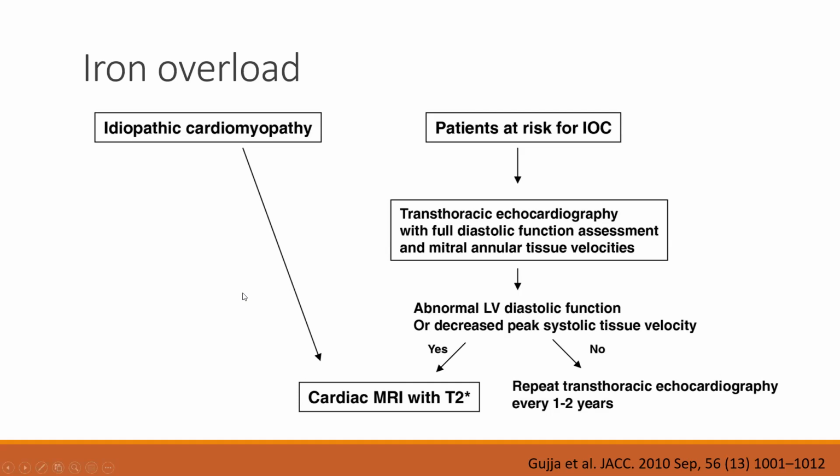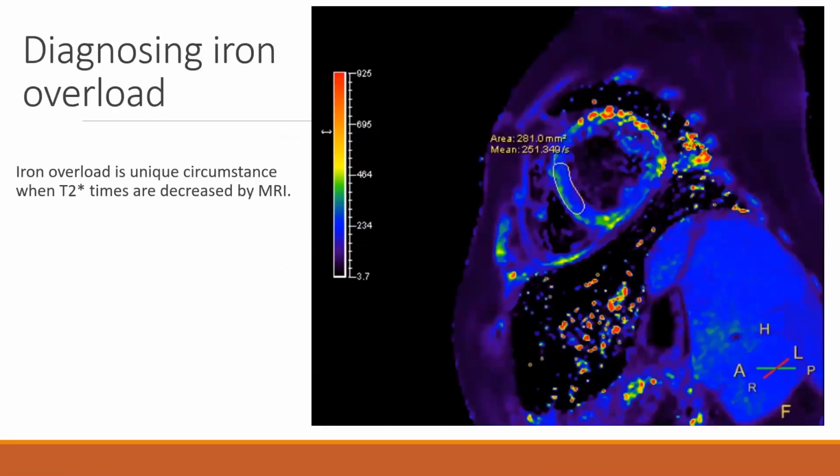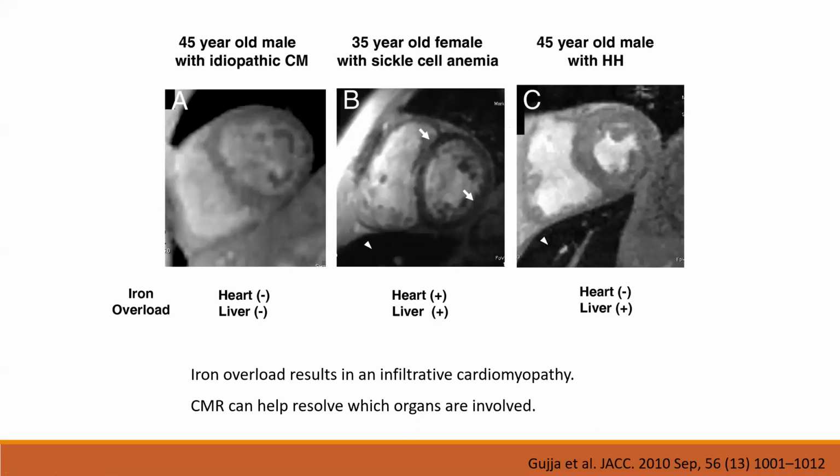For the purpose of iron overload, cardiac MRI with T2 star mapping is very good at detecting iron overload in the heart. Iron overload is a unique circumstance when T2 star times are decreased by MRI. There are very few conditions that result in that. Here's a patient from a study in JACC a couple of years ago. A 45-year-old man with an idiopathic cardiomyopathy undergoing cardiac MRI, where things are normal. A 35-year-old lady with sickle cell anemia who has had iatrogenic iron overload from blood transfusion, and you can see that the heart as well as the liver is involved. We typically see that in patients that have iatrogenic iron overload. And the last one is a patient with hereditary hemochromatosis where the liver is involved, but not the heart. So CMR can help differentiate these conditions that way.